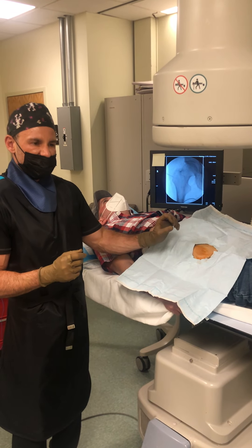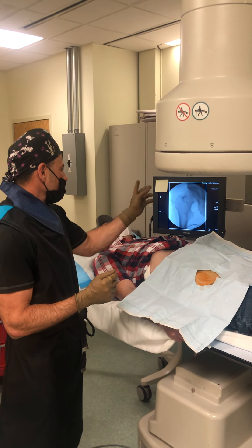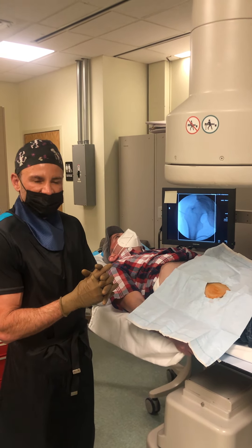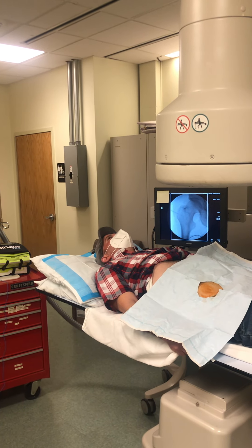Today we're doing platelet-rich plasma injection for the hip. This middle-aged gentleman has some arthritic changes as well as some labrum tears. The hip has significant issues with ambulation, so we're going to do the procedure from A to Z.